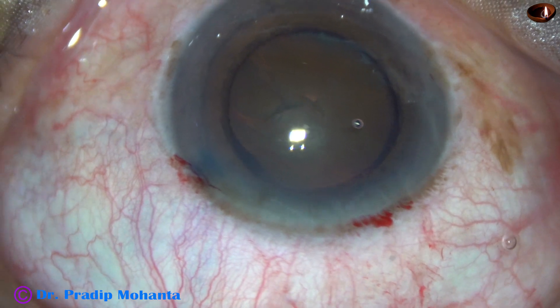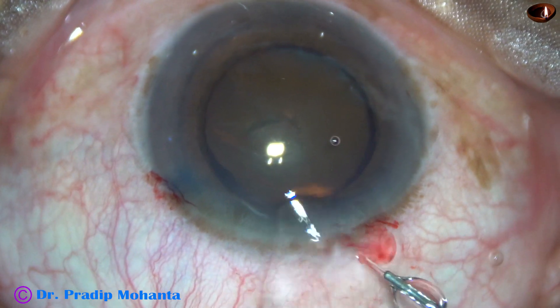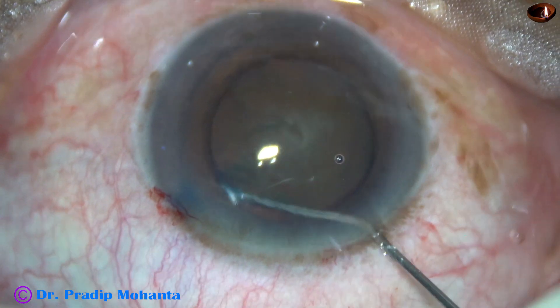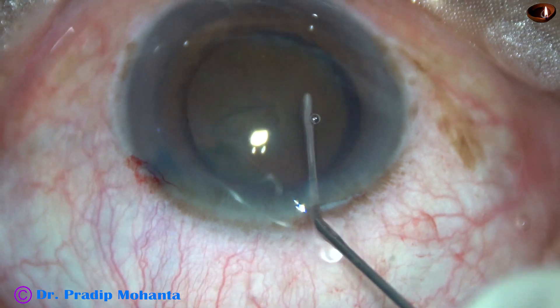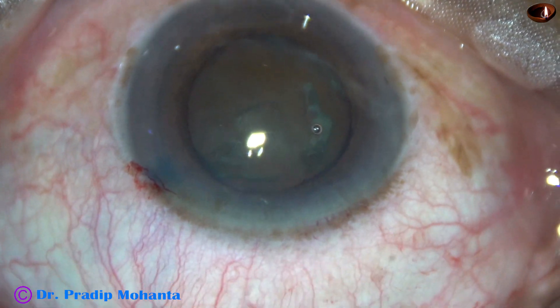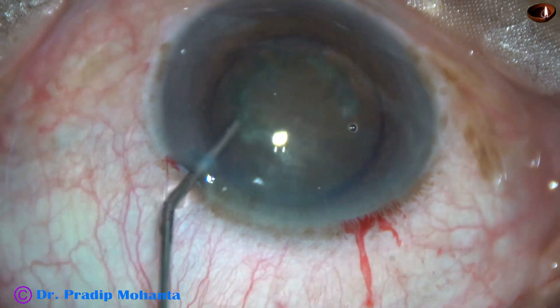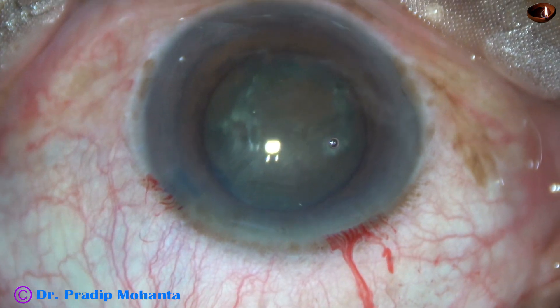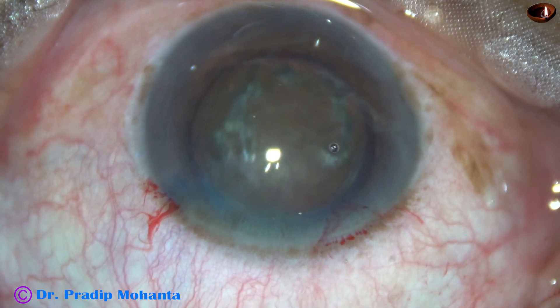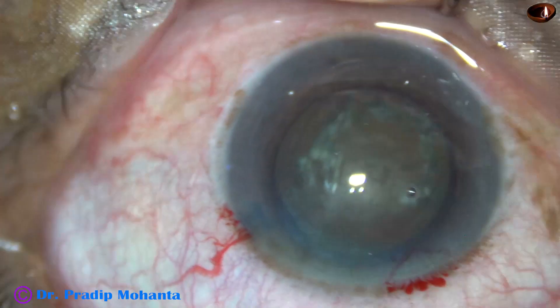The pupil has dilated about 6 mm and the size of the rhexis is about 5.75 mm. And now, hydrodissection. As soon as we do hydrodissection, the iris gets tucked a bit, and the pupil tends to become smaller. However, the size of the pupil is adequate till now — about the size of the rhexis, about 5.75 mm. After application of the visco, the pupil size has increased a bit. We can call this viscomydriasis.